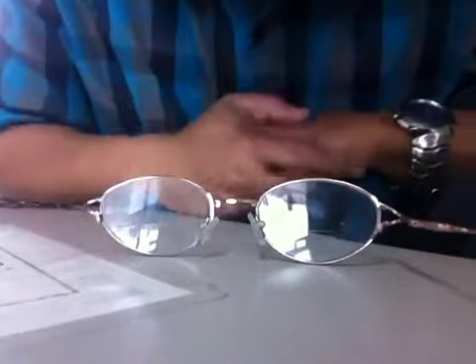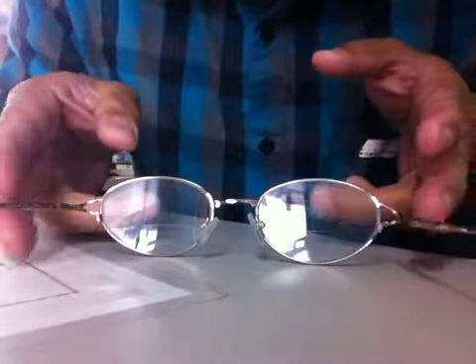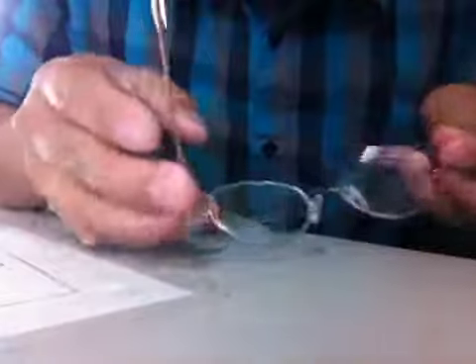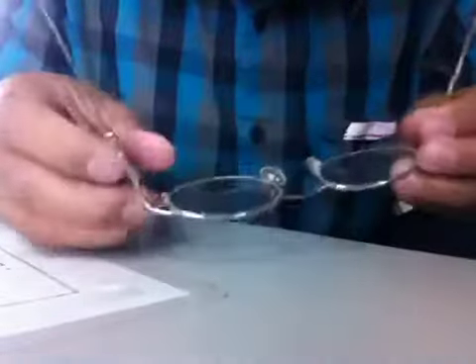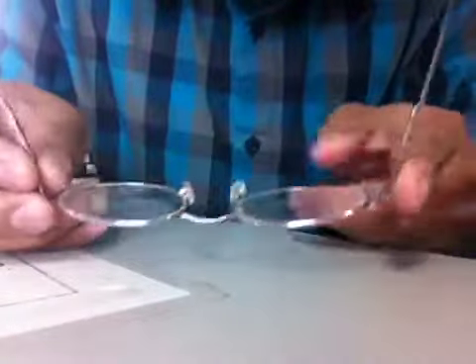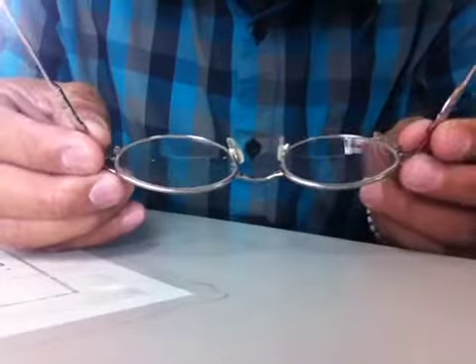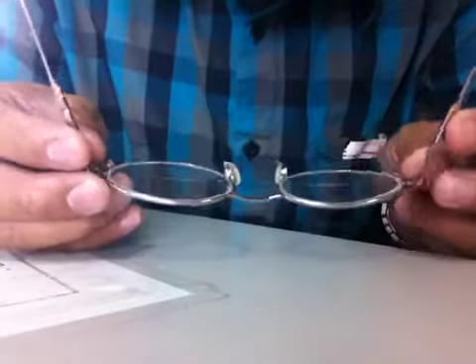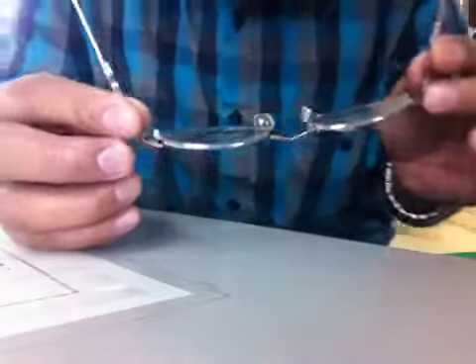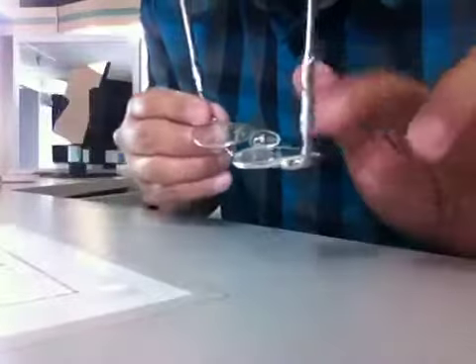I'm gonna show you how to adjust a metal frame without using tools. Your glasses are really wide like this. If you don't have any tools or there's no optical shop, you can do it by yourself. It's so simple — you don't need any tools, you just have to be very careful.